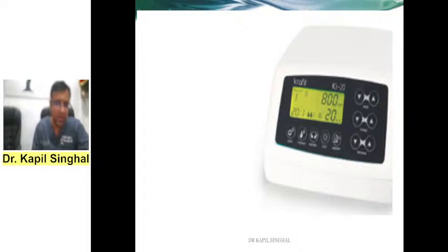Now this torque can be checked with an implant motor, that is your implant physiodispenser. Your physiodispenser has torque values from generally 5 Newton centimeter to 80 Newton centimeter. So depending upon what value of torque the physiodispenser is showing, you will come to know how much torque you have achieved in your implant while placing it in the bone.